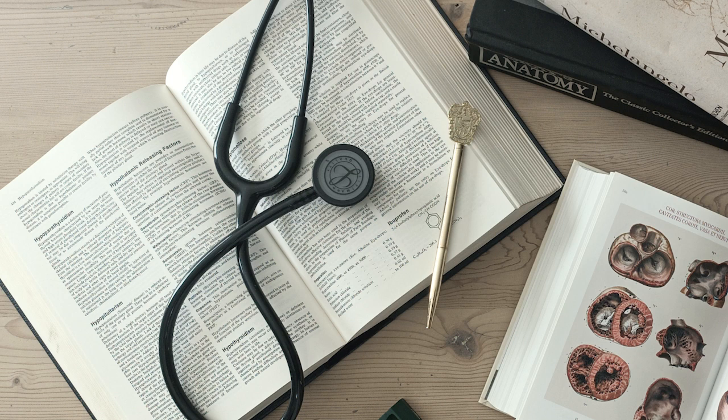Okay. Think of your ECG as a camera only snapping a picture when there's movement or a change in electrical charge. That P wave only shows up when the atria are actively depolarizing, creating an electrical wave for the machine to detect. And once they're all depolarized? Once the entire atrium is depolarized, it's electrically flat again, relatively speaking, and the line goes straight.